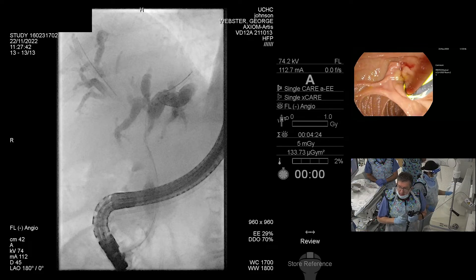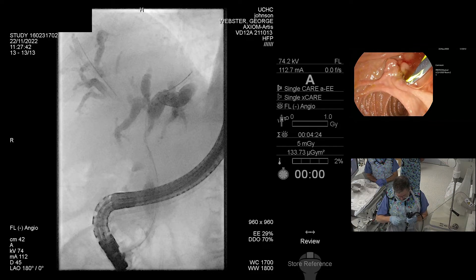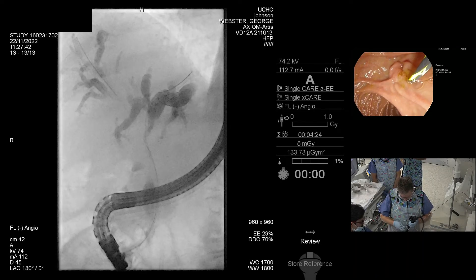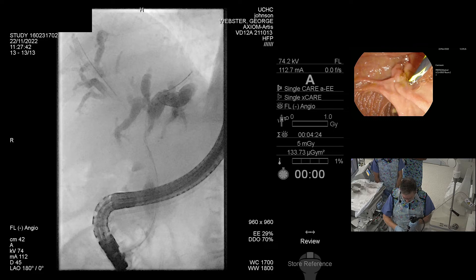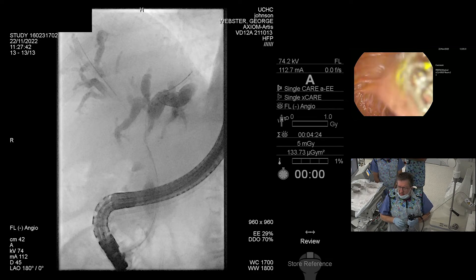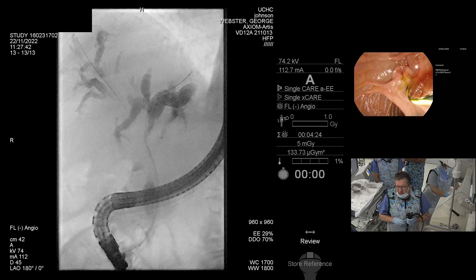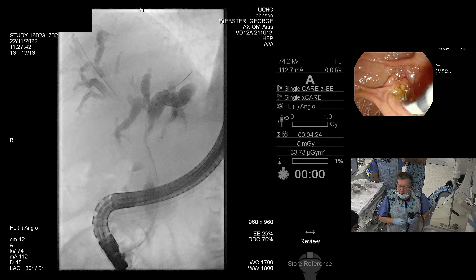One of the advantages, of course, of using two different wires is that you don't get confused as to which one you're putting a stent or an instrument down, which can be a little bit embarrassing if you get that wrong. We're going down with the Cook 8.5 to 15 millimetre fusion extraction balloon. I just want to define the stricture of the right anterior — we've defined the left duct stricture nicely. I just want to be sure exactly how far proximally the right anterior stricture goes.